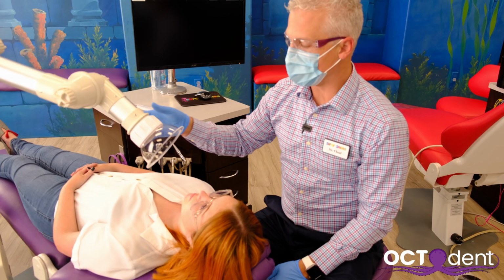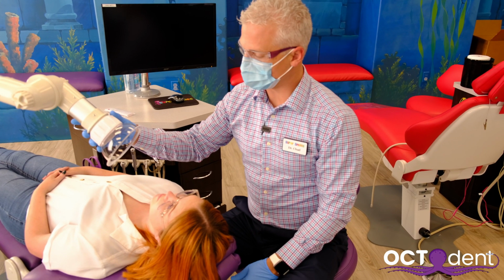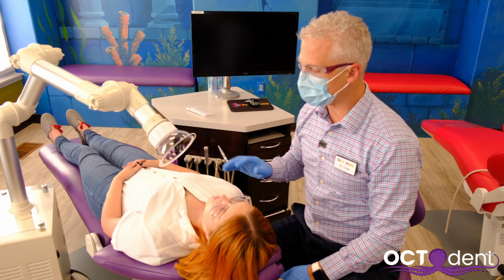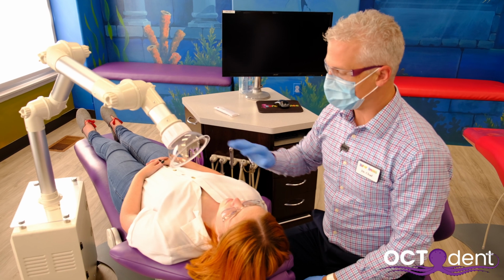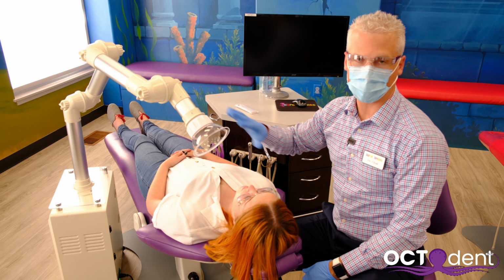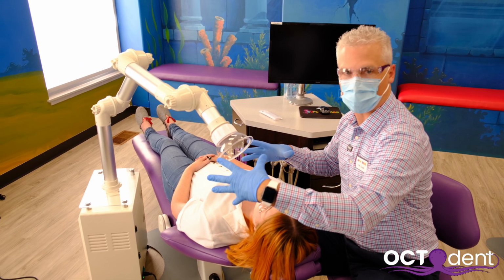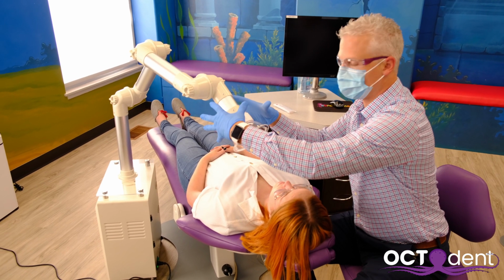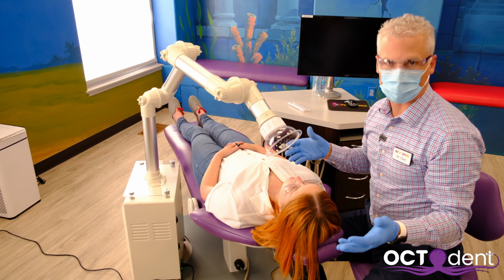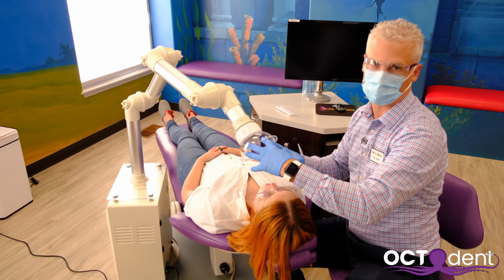Now, if I had a patient that was really wiggly, or I knew was going to sit up, I might back it up even a little bit further. Okay, and at this level, I might need to have this unit at a level 10. This is about a foot away from the patient. I need to have this at a very high volume because we're trying to suck all of the air in this area into the unit. But as you can see, even just moving it forward 3 or 4 inches makes a huge difference on how much it's going to be able to suction right in this area.